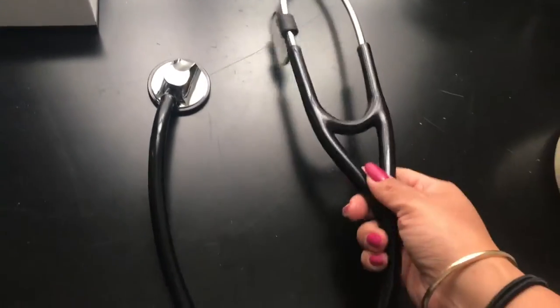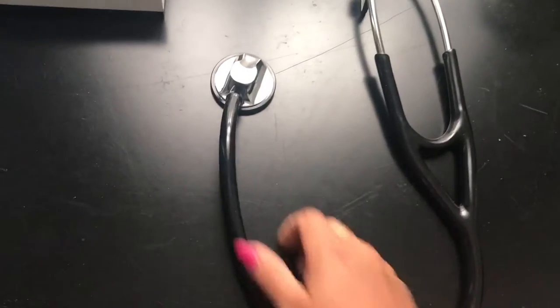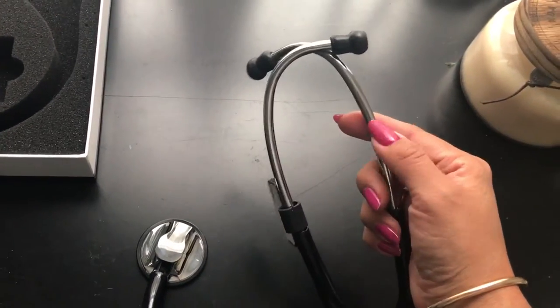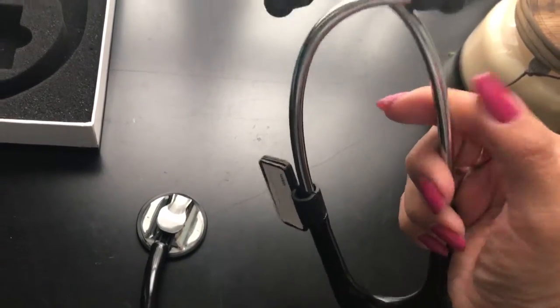It's covered in a very firm plastic, so it's quite durable and stable. It still feels like a really good quality product, and it comes with some earbuds already installed.